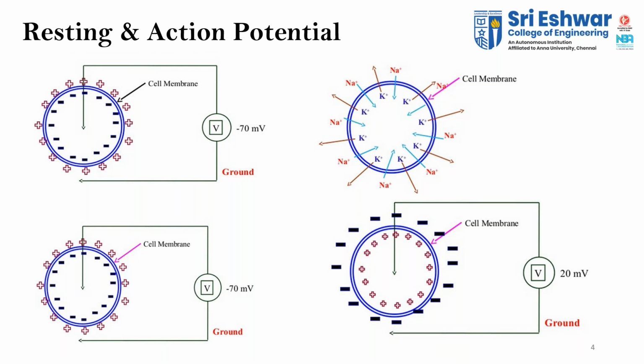That ionic current is converted into electronic current using the electrode, so an electrode is a transducer. After getting the electronic current, I give it as input to my amplifier to get boosting. After boosting my signal, I'll diagnose the patient. This is what happens with your biosignal.